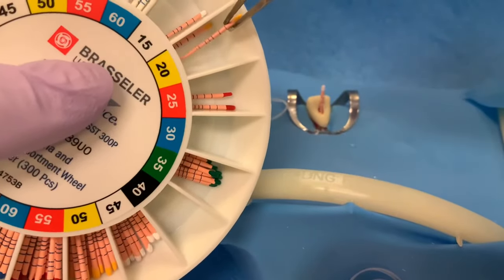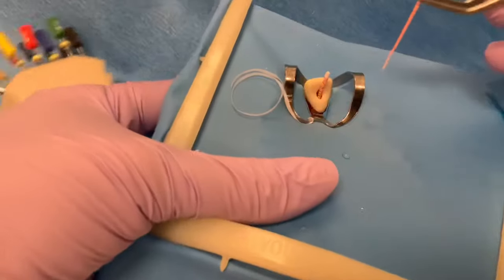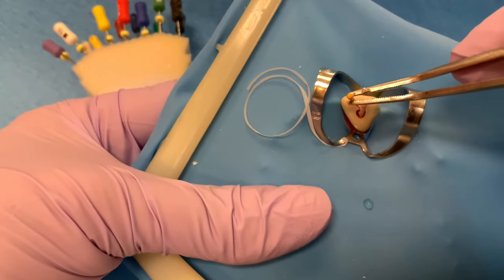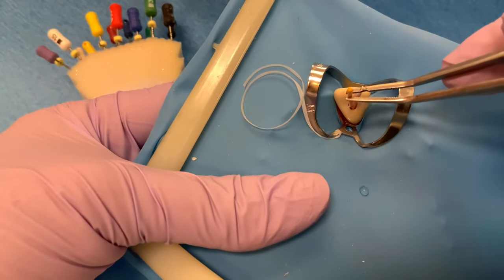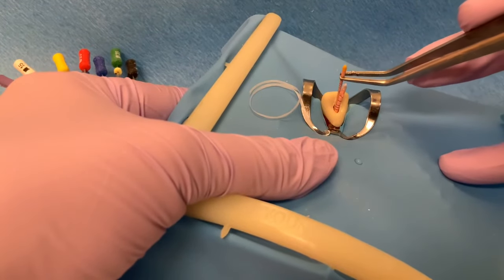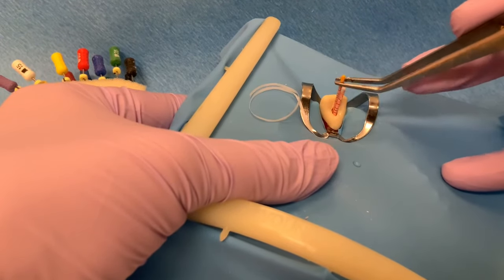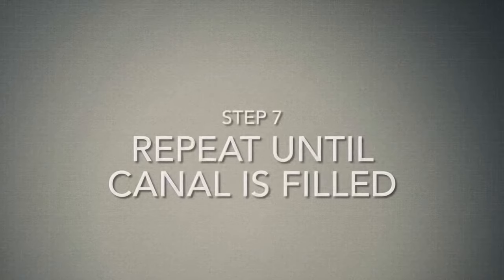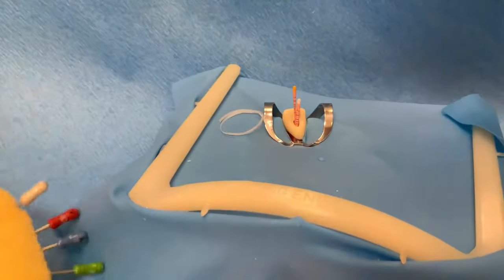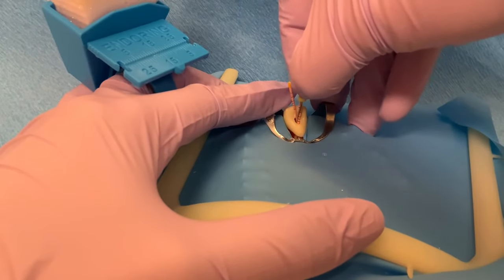Select an accessory cone that is similar in size to the finger spreader and coat this cone with a small amount of sealer. Insert the accessory cone in the space created in the previous step. Carefully insert the cone, otherwise the tip will bend. The cone should be inserted to the same depth as the finger spreader. The process is repeated until the spreader no longer goes beyond the coronal one-third of the canal, or when you can no longer seat any more accessory cones within the canal.